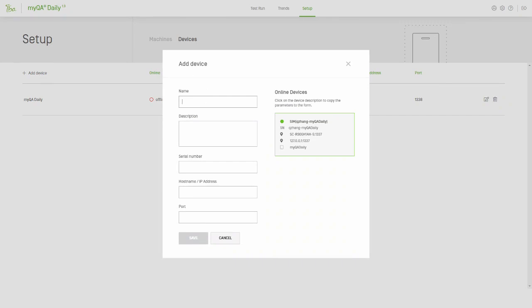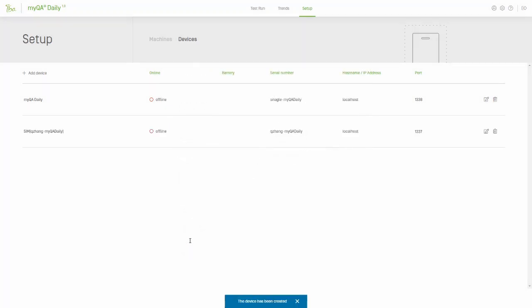Once the device pop-up loads, you should see your MyQA Daily device visible on the right, assuming it's turned on and connected by Ethernet to your computer. Simply click the gray box to auto-populate the device details and revise the name as needed. Click Save once complete to return to the device list. Here you should see your newly added device listed and showing as online.